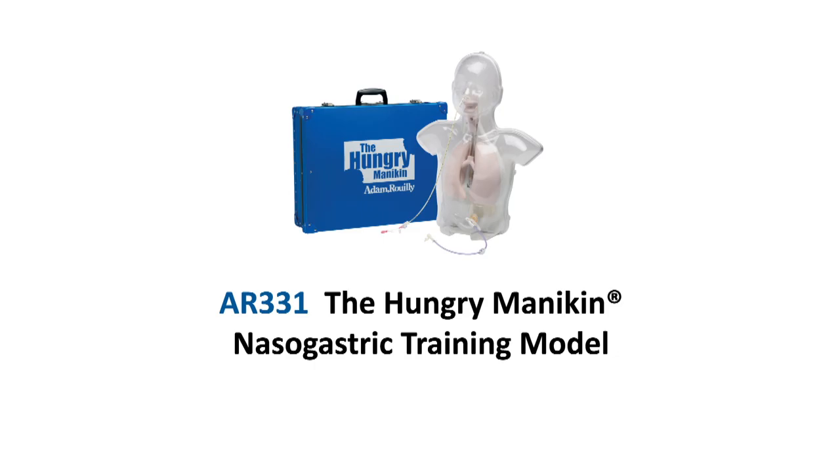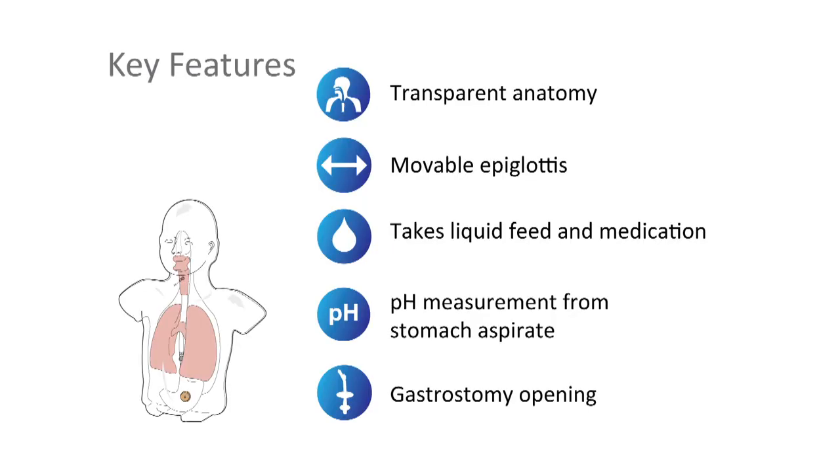The award-winning and best-selling Adam Rooley AR331 Hungry Mannequin was designed by nutrition nurses at Birmingham Children's Hospital to demonstrate to parents and carers the technique for inserting nasogastric and gastrostomy tubes in children. This simple-to-use simulator helps identify the stages of placement, ensuring that the nasogastric device is passed safely and correctly.